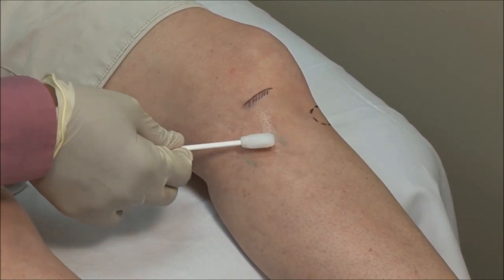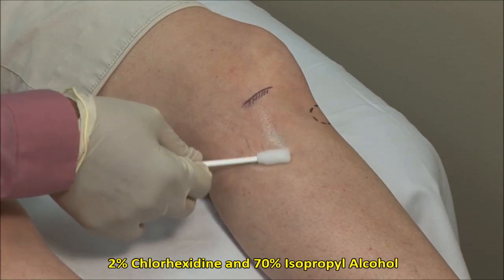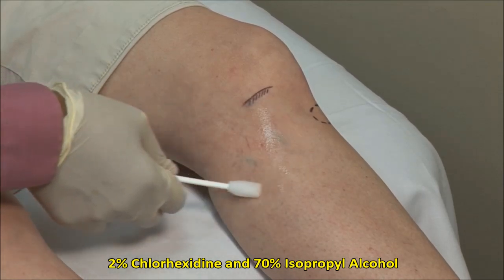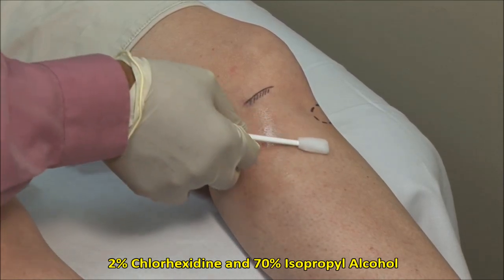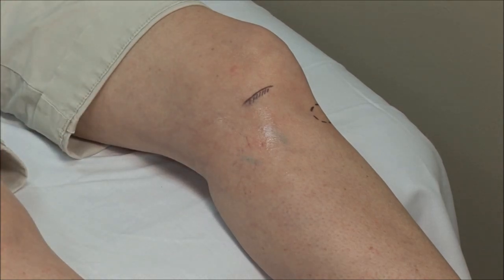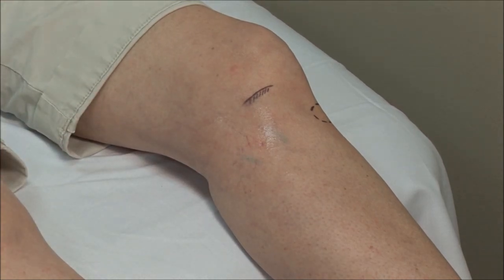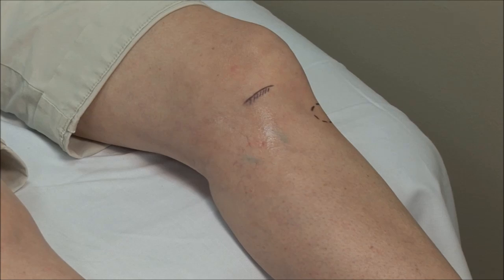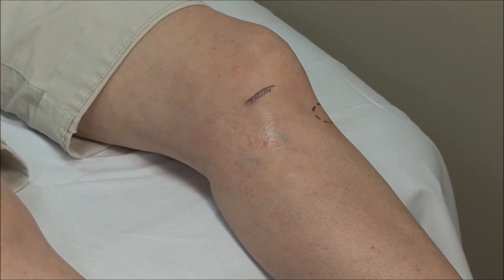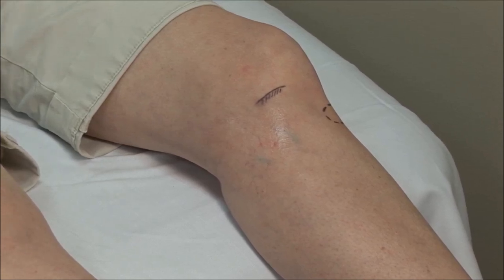I am using a mixture of 2% chlorhexidine and 70% isopropyl alcohol. Local anesthetic can be applied to the skin and subcutaneous tissue using a 25 gauge needle, but the experienced clinician may forego this.